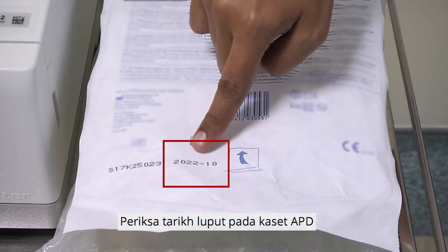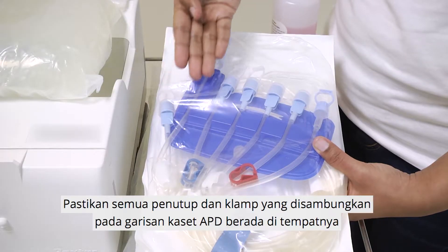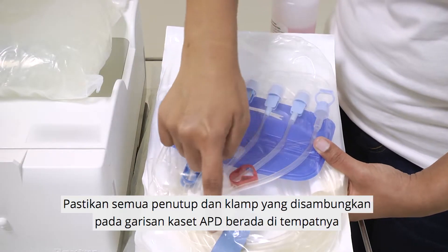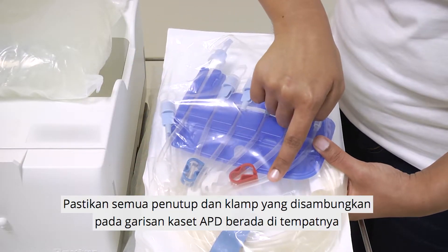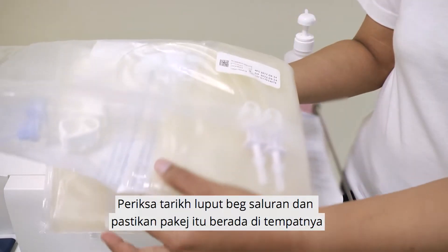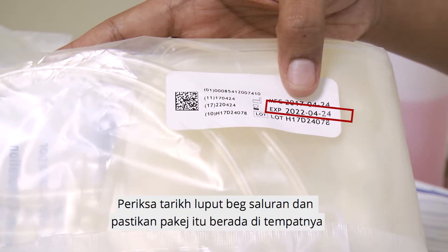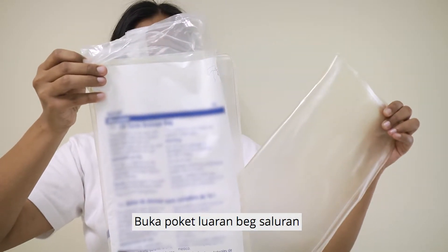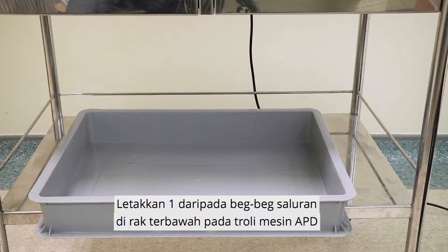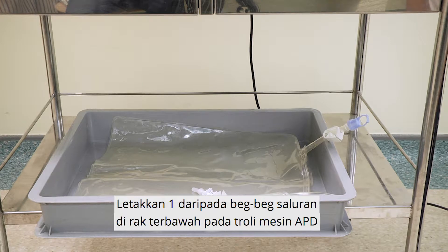Check the expiry date of the APD cassette. Ensure all the clamps and caps attached to the lines of the APD cassette are intact. Check the expiry date of the drain bag and ensure the package is intact. Open the outer pouch of the drain bag. Place one of the drain bags at the bottom shelf of the APD machine trolley.